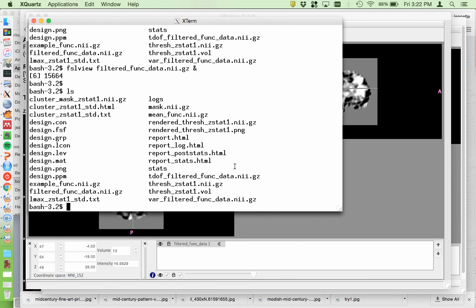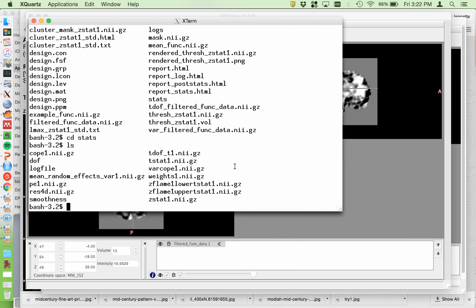Let's go into the stats directory. That again is where the z stat statistic is. There's a t statistic here too, but I usually use the z statistic for viewing because then you don't have to worry about degrees of freedom.